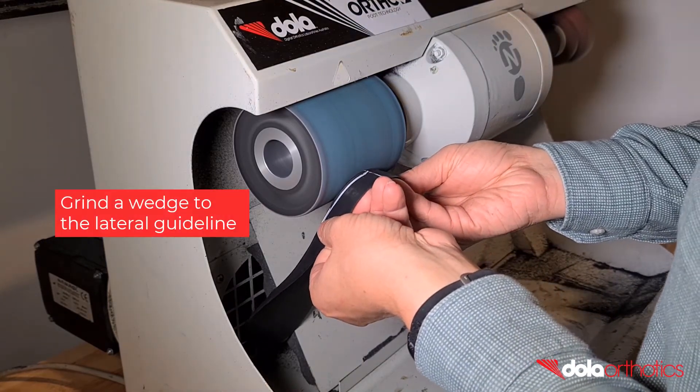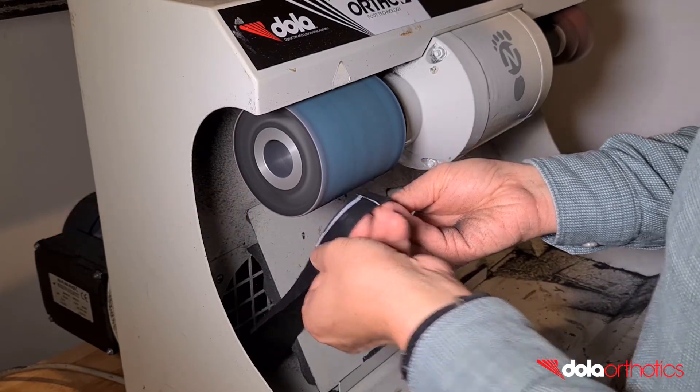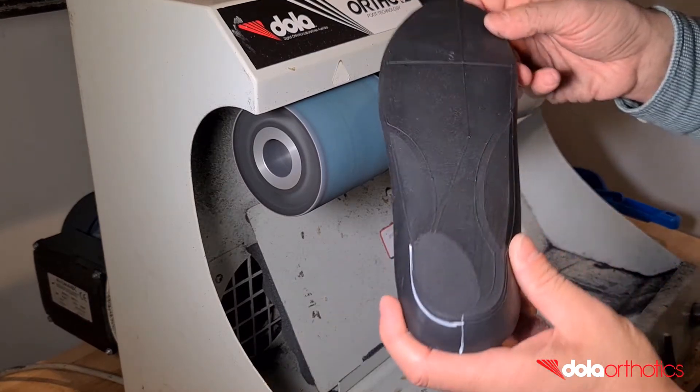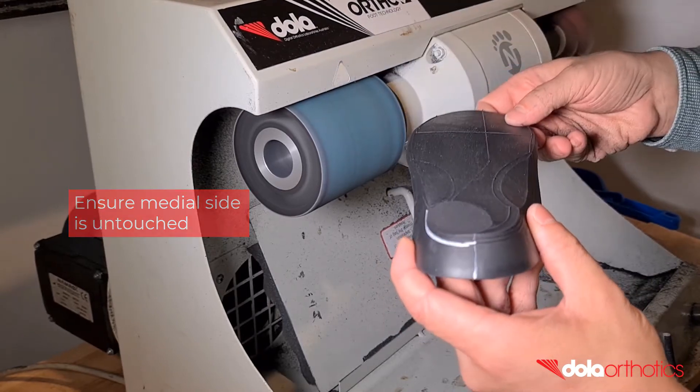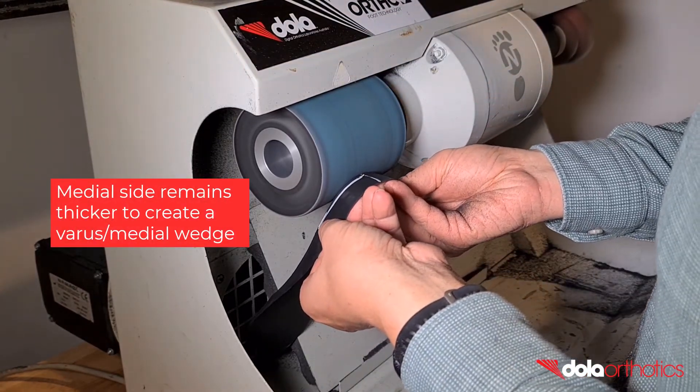Holding the medial and lateral sides of the orthotic shell, place the posterior plantar heel surface of the orthotic against the grinder. Hold the orthotic at an angle and remove material up to your lateral guideline, ensuring that this angle keeps the medial side untouched. The medial side will remain thicker than the lateral, creating a varus or medial wedge.